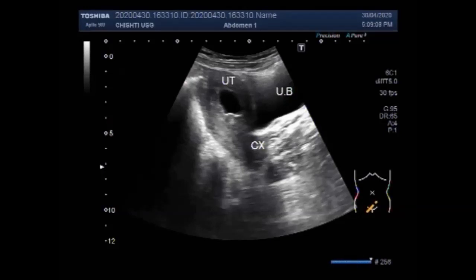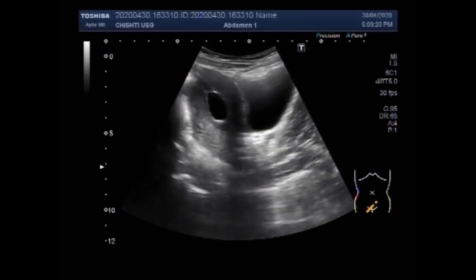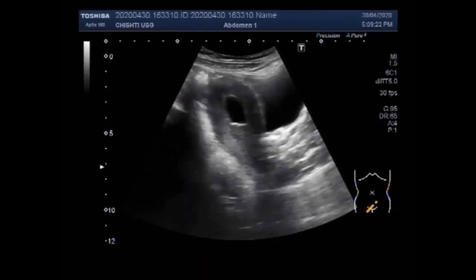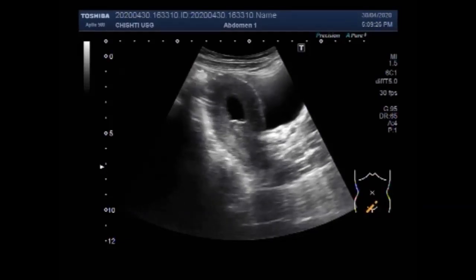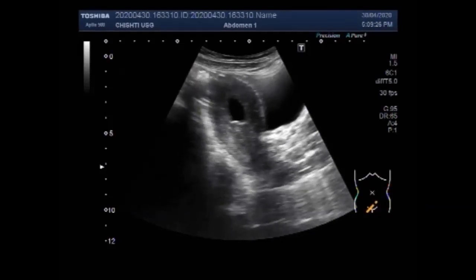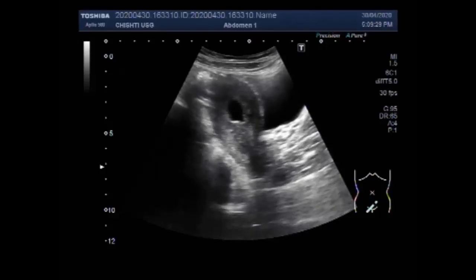An embryo is usually seen within the gestational sac by six weeks of gestation. One of the more common types of miscarriages, known as anembryonic pregnancy or empty sac or blighted ovum, happens when a gestational sac doesn't contain an embryo.